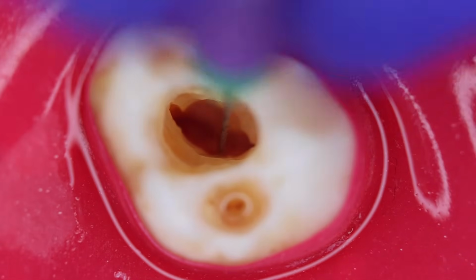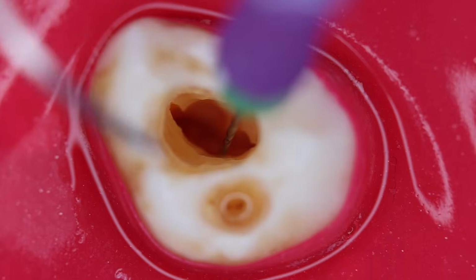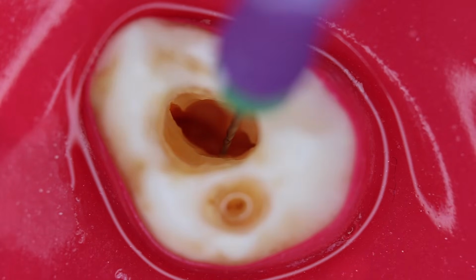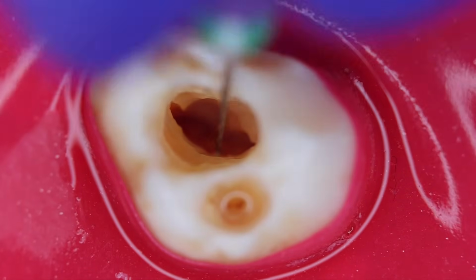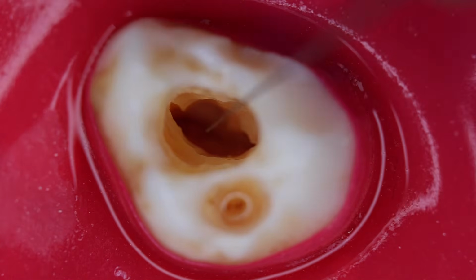Then try to identify the distal orifice. Over here you can see that there is a distobuccal canal, with the orientation of the file going towards the distobuccal cusp. Just remove it, and then you should be able to identify the mesiobuccal canal.